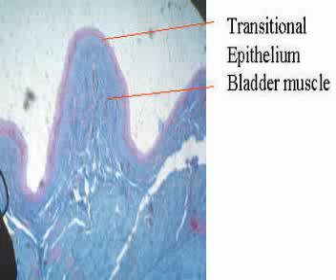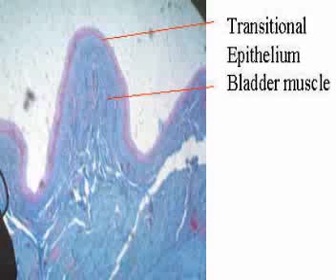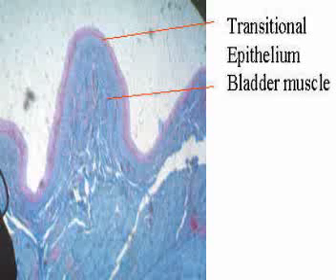Transitional epithelium is the bona fide urothelium of the urinary system, beginning with the kidney collecting duct and extending through the ureter to the urinary bladder and proximal part of the urethra. It is about 4 to 6 layers thick and hence a bona fide stratified epithelium. It is a stretching epithelium and it can stretch for a great length without distortion. When not stretched, the basal cells are cuboidal in shape. The surface cells are larger and octoploid.